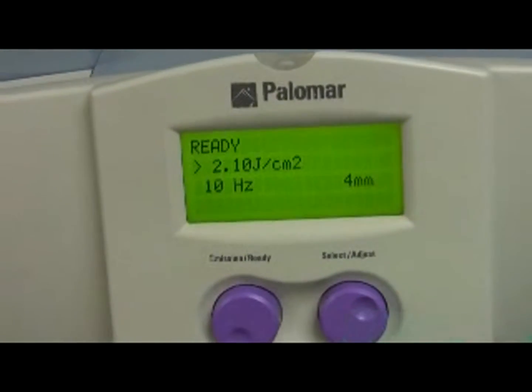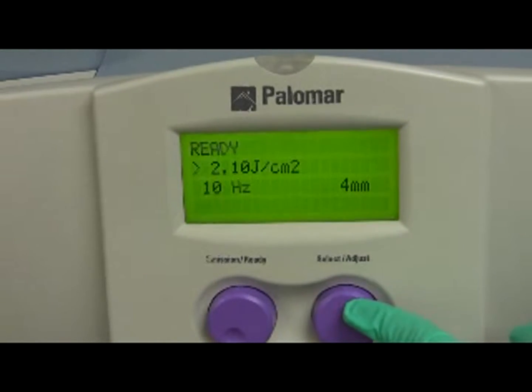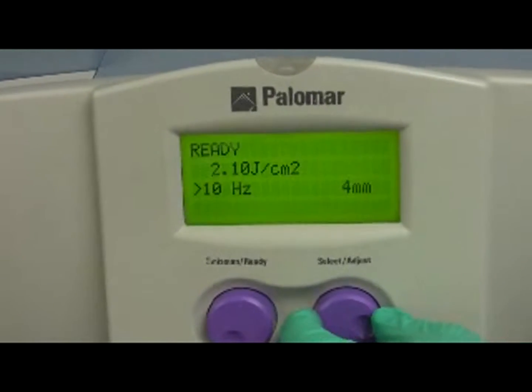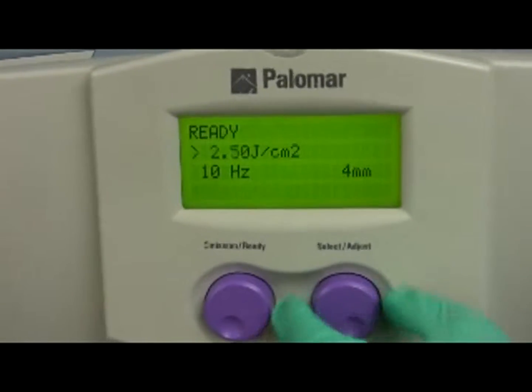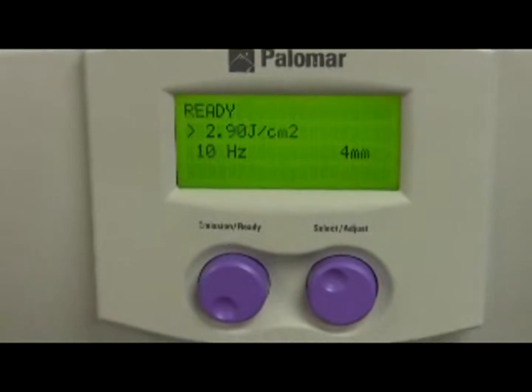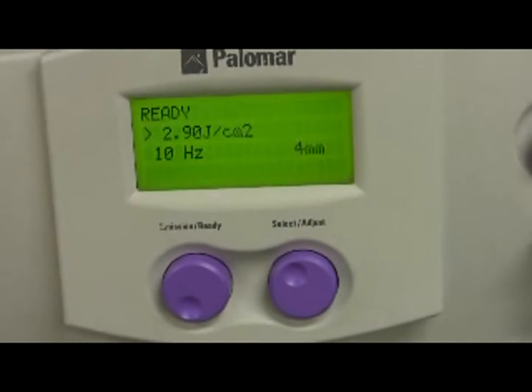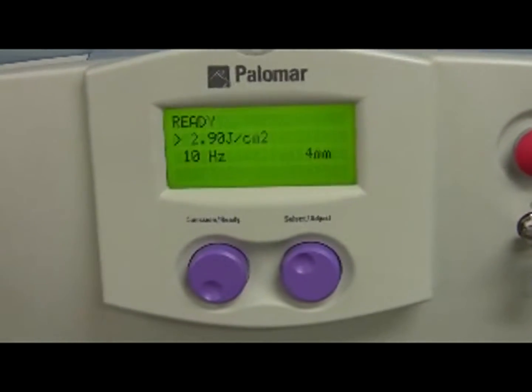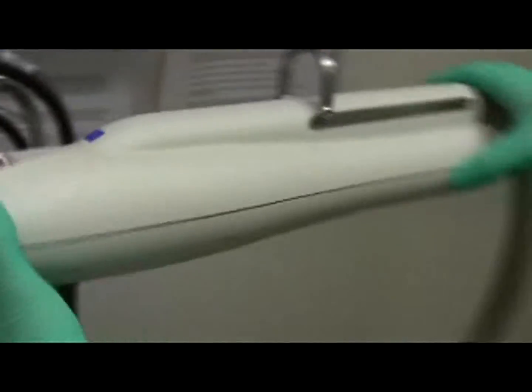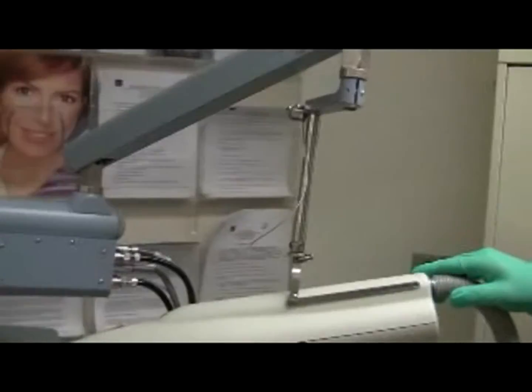The arrowhead will indicate which parameter is being adjusted. It starts at fluence, goes to frequency, then goes to spot size, and then back to fluence. Note that the spot size can be adjusted either on the handpiece or via the selection button dial. Input all desired settings: wavelength, spot size, fluence, and pulse frequency.